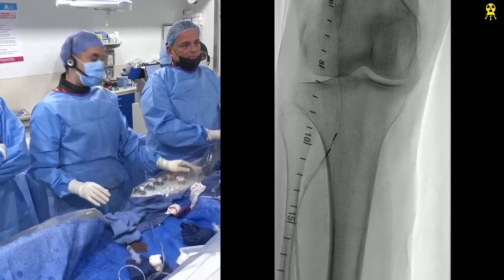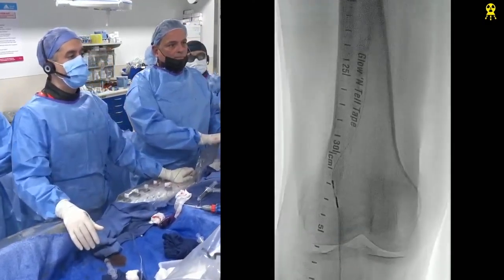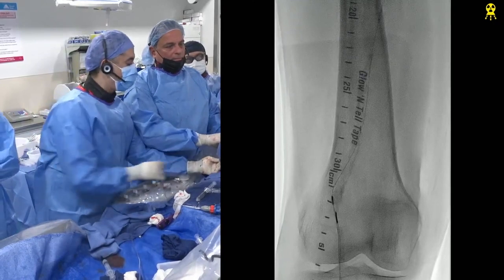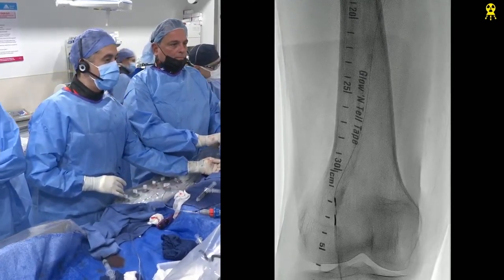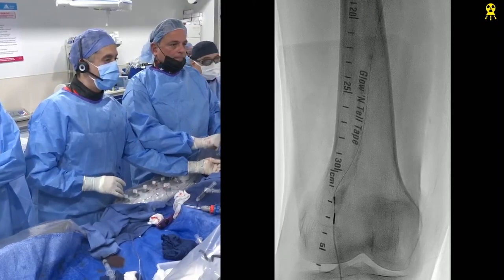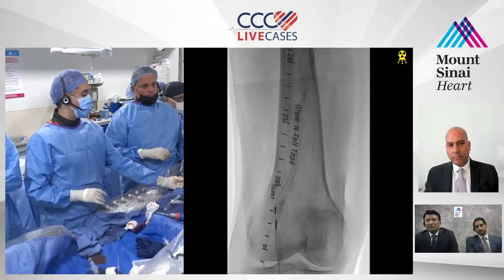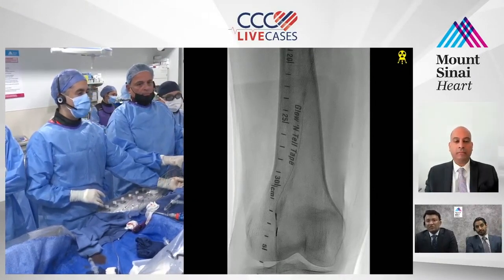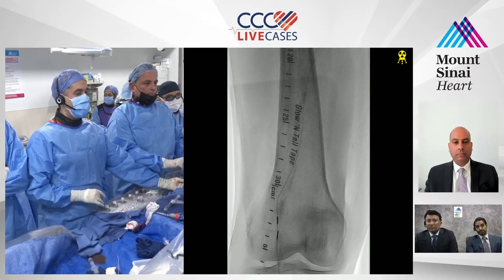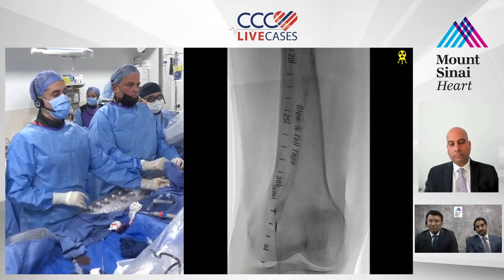Oh, you stand corrected. No, I'm telling you, Ajit, I feel like this has more tapered flow than anything else. Outback just is a smaller device, but this is more tapered, to cross through the bends much easier. Yeah. It makes the bends much easier. But calcium is the problem for this device. Yeah. If you have too much calcification, you have to make a bigger lumen for this device. Yeah, it's a bulkier device, you're right.